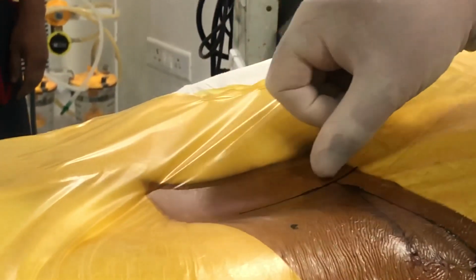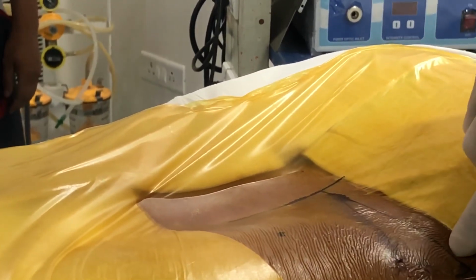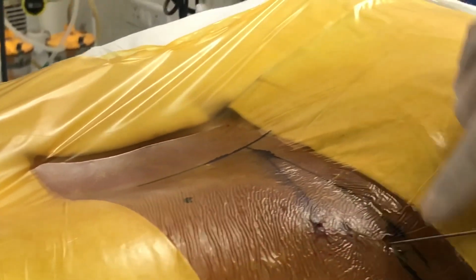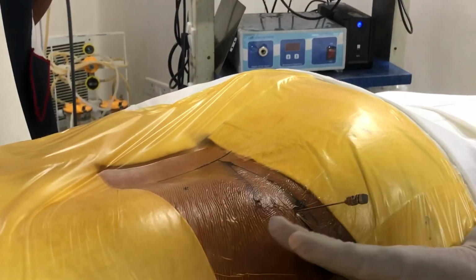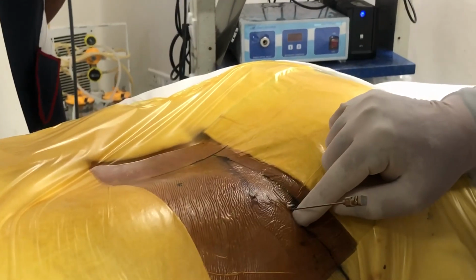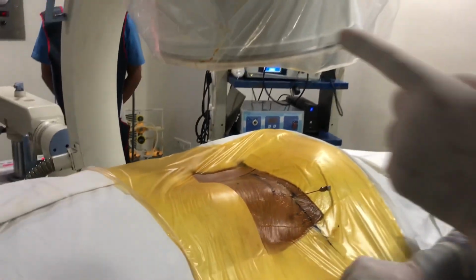We have marked the center line, the interspinous line. After that, we have marked the disc line. After marking the disc line, we measured the disc height after compensating for the lordosis. As you can see, the disc line is a little anterior to the AP line. The lateral line is a little higher than the AP line. This gives me my entry point, which I have adjusted.